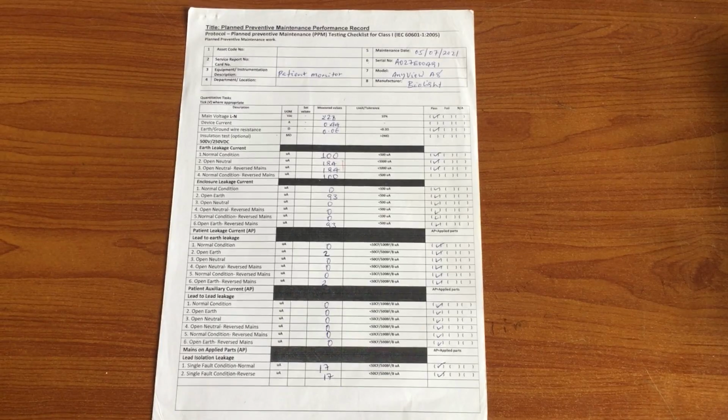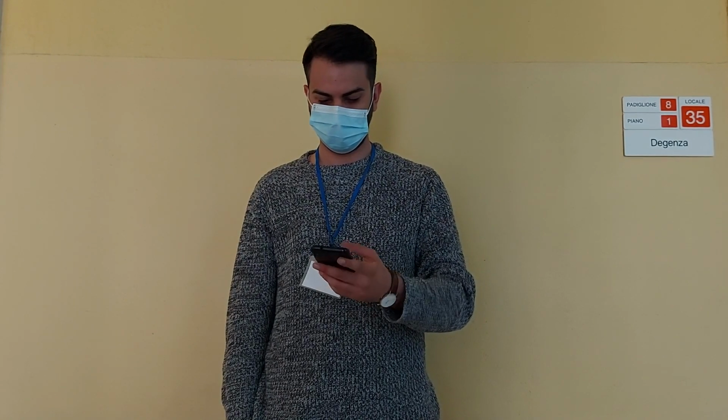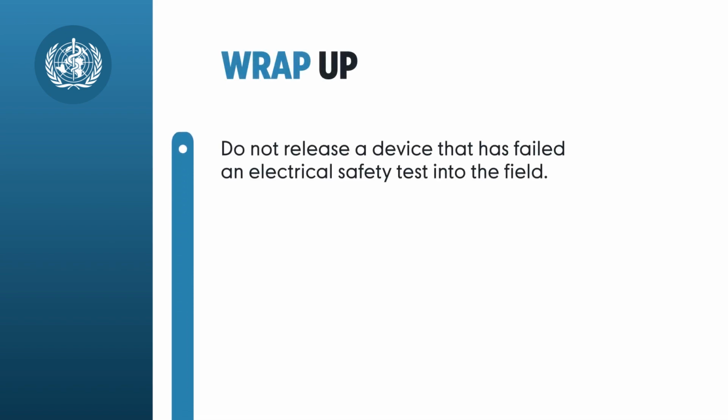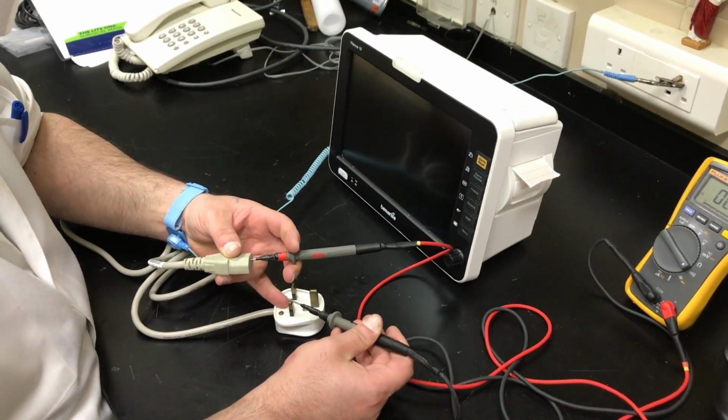If the device did not pass one of the tests, double-check the failed section of the test. If verified, you may consider troubleshooting the problem. Otherwise, you can contact the vendor directly or through your administrative process. Do not release a device that has failed an electrical safety test into the field. If the device passes, continue on to performance verification tests.